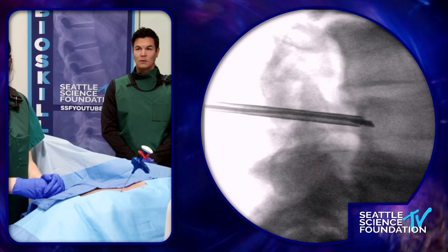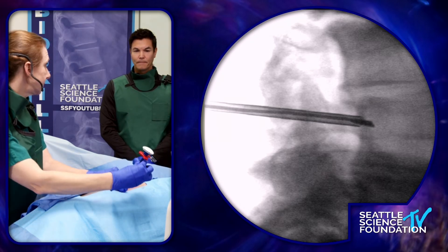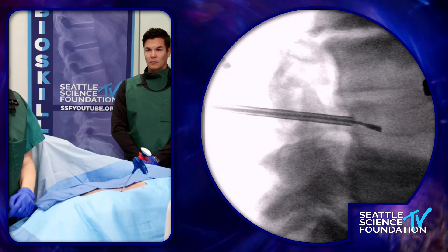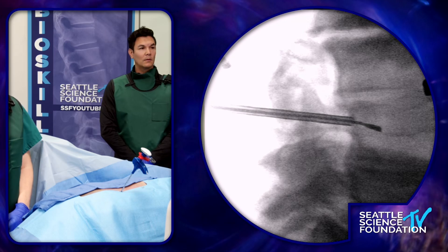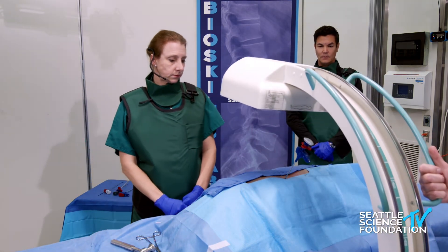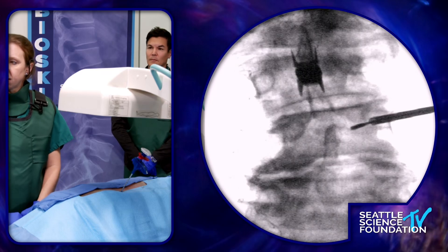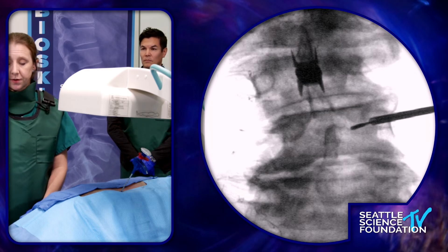I see that the J tip may be a little inferior in the vertebral body if I don't adjust now, so I'm just turning my whole assembly. We can already see that the paddle at the end of the J tip is starting to shorten a little bit. I'm going to look and see where I am on AP to make sure it's progressing in both dimensions as I'm desiring. My hope is that it's approaching the spinous process — which it is. It looks like if it continues on this trajectory, it's going to be right in that 50 percent position between the superior and inferior end plates.